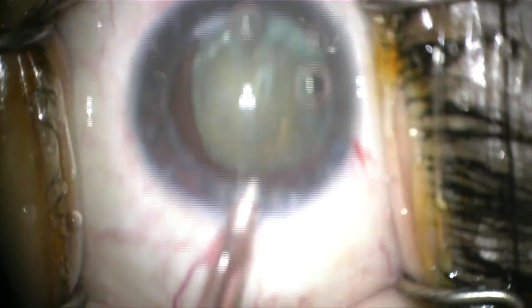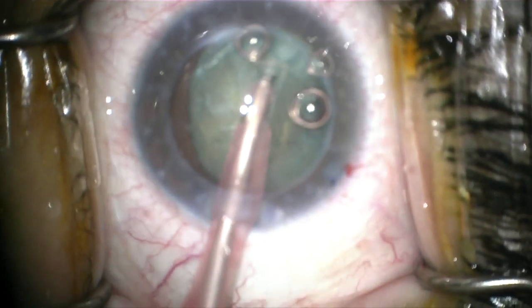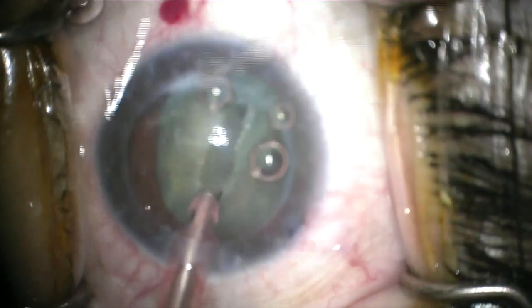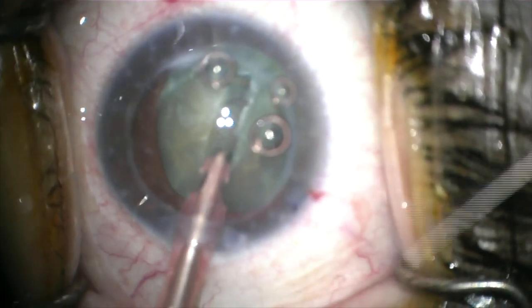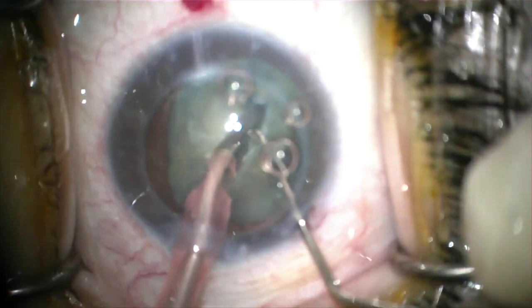Because this was a dense cataract, I did a modified stop-and-chop technique for nuclear disassembly. During your nucleus removal, you want to be quite cautious of the amount of energy used. And again, feel free to replace your dispersive viscoelastic at regular intervals to protect the endothelium if needed.